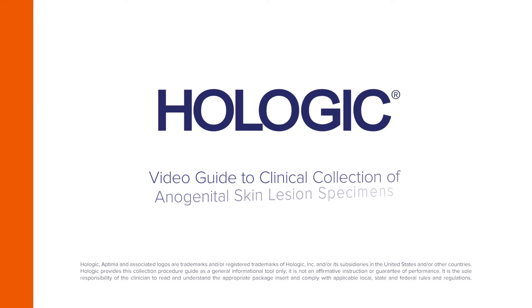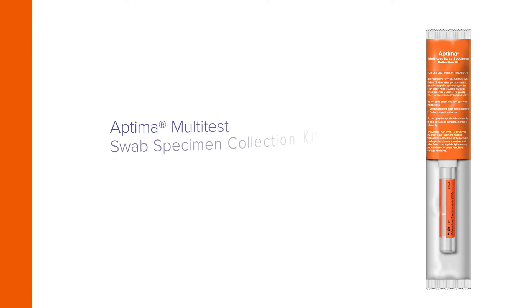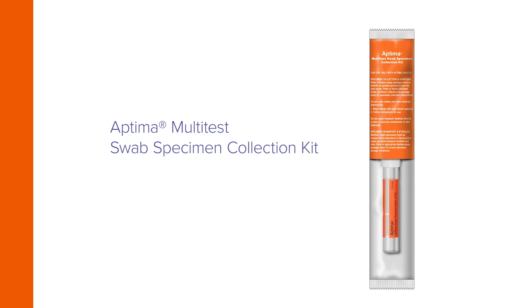Hologic presents a video guide to the collection of anogenital skin lesion specimens by clinicians using the Aptima Multitest Swab specimen collection kit.